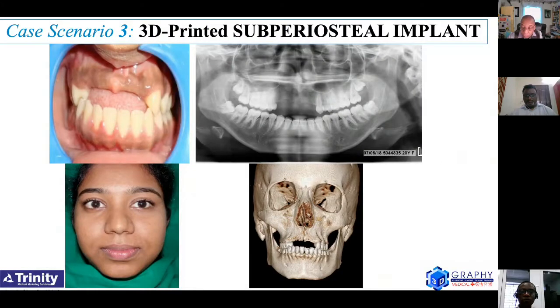Okay, this was another lady where Dr. Godfrey spoke about the use of full crown zirconias. This patient came to me with partial edentulousness, and she was referred to me by one of my close friends, and I was told to fabricate an implant in that particular area. This patient, being a student, didn't have the time because she had multiple teeth missing, and she had a road traffic accident from which she had lost all her bone in the front of the upper maxillary portion.